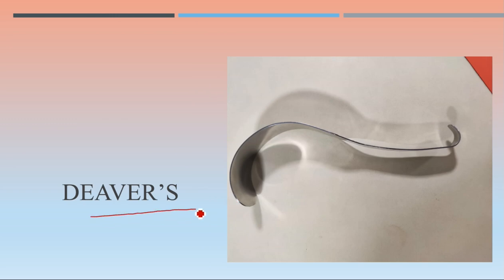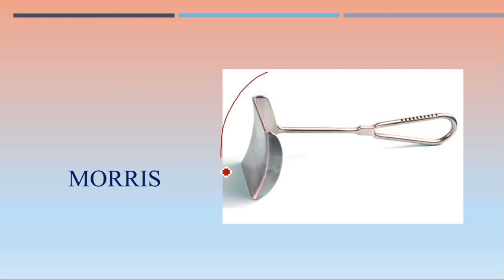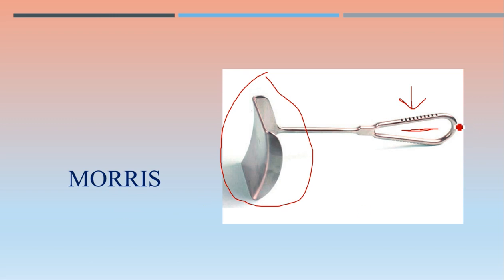Then the Doyen retractor, very commonly used during abdominal surgeries — you hold it from the handle and this portion goes inside the cavity. Morris retractor: this portion goes inside the abdominal cavity and this is the handle to hold. It is hollow to make it lightweight. Another variant of Morris retractor has two blades on each side, but the commonly seen version has one blade.